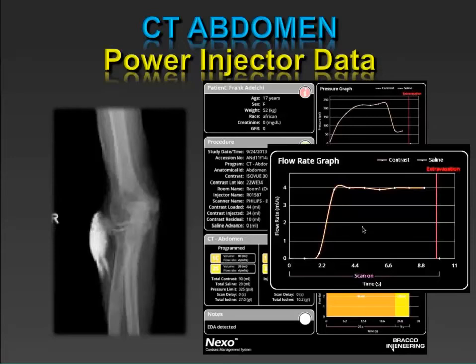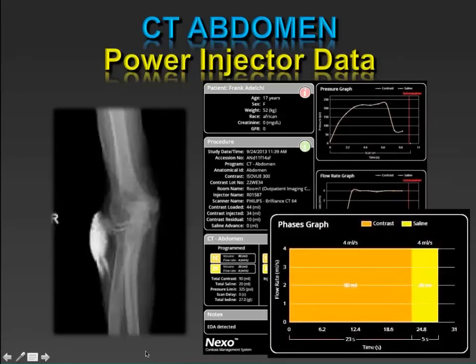So this will be very helpful for us to know exactly what happened during the contrast media injection. I think this technique will allow us to self-examine to see how well we're doing, to see where we can make changes to improve our practice. It may allow us to reduce doses in some patients. It may suggest that we increase doses in other patients. But overall, it's a very exciting technology that allows us to do a better job at what we're doing.